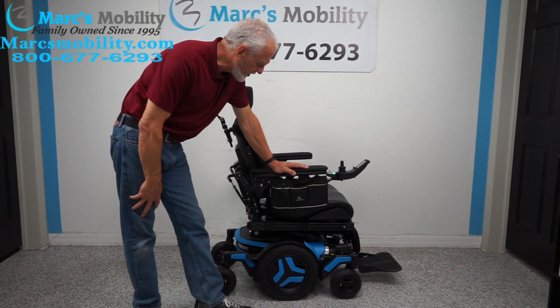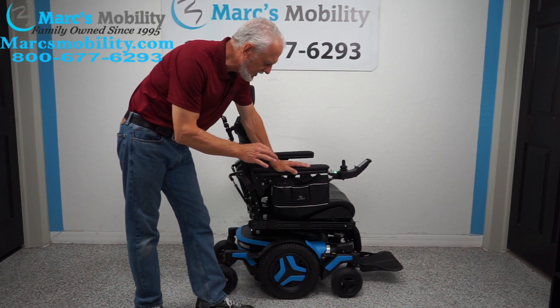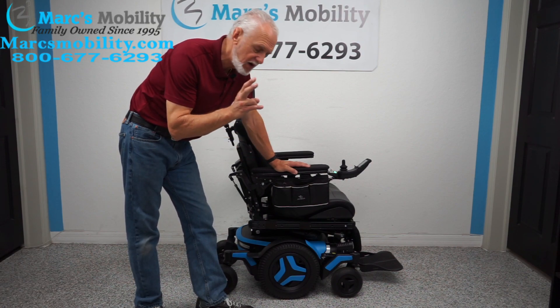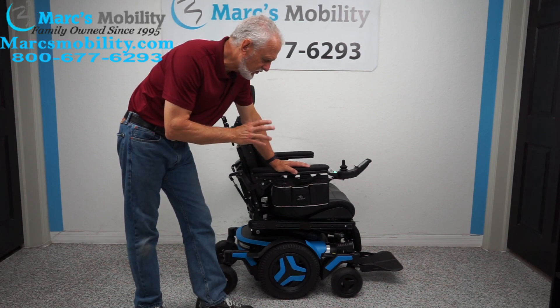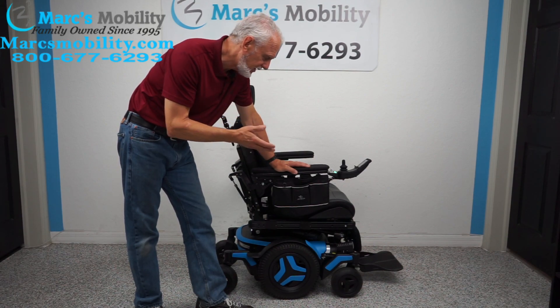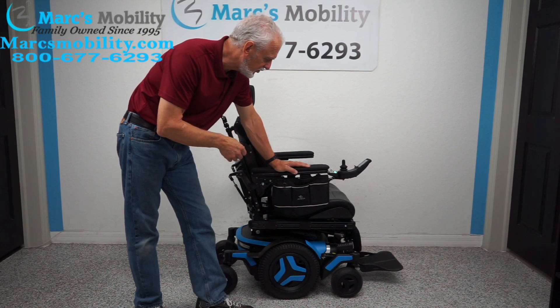We have a beautiful chair here — a Permobil M3 in blue. It has 41 miles on it and was used for about two months. If a person uses their power chair daily, they'll put about 25 miles a month, 300 miles a year. So with 41 miles, it's probably less than two months of use.